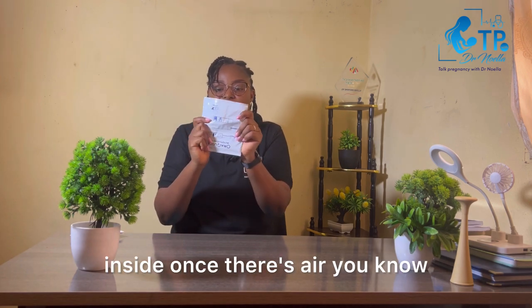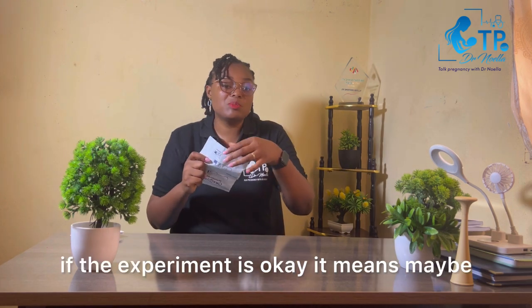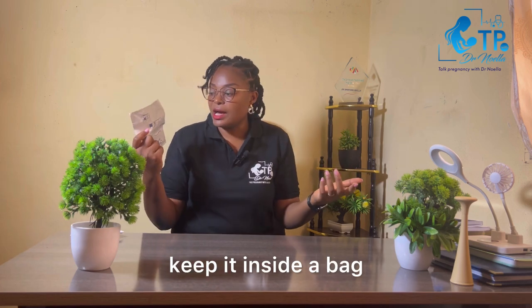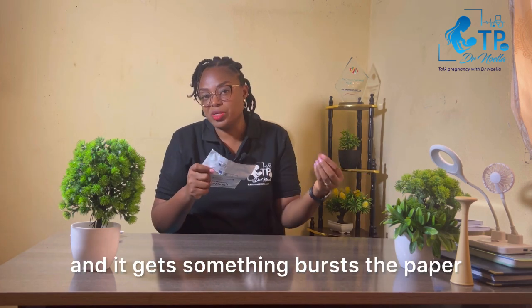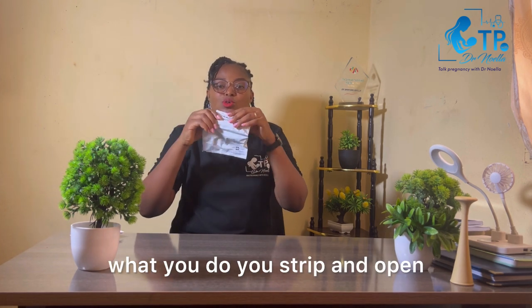Once there is air, you know that it is still good. Even if the expiry date is okay, something might have burst — you might keep it inside a bag and something pierces the paper — so you just have to make sure that the air is still there. Once confirmed, you strip and open the kit.